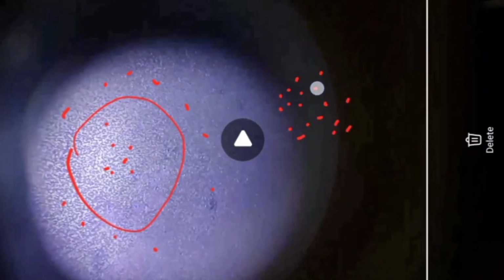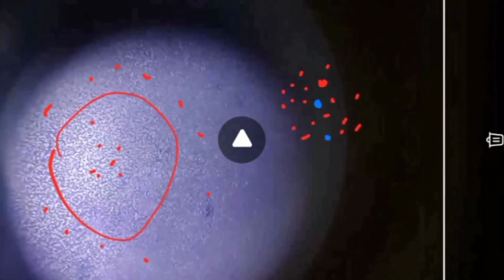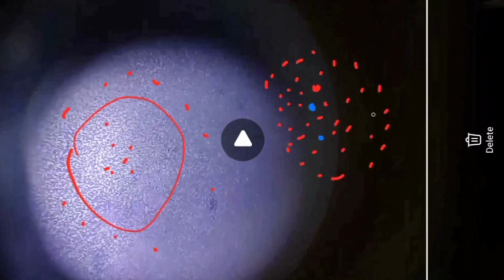Yeah, see, these are actually cells. These small things are actually cells. Here in this slide we have everything: RBC, WBC and platelets. So we will see so many RBCs, and in between the RBCs you will see one or two WBCs. So we will get hundreds of RBCs in one slide and one or two WBCs of different cells. Wow, this is a very clear picture. See, these are the cells. But as the magnification is very low, the size is very small.